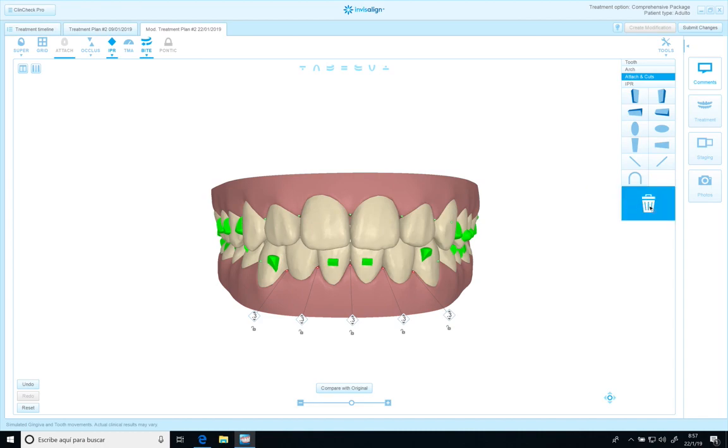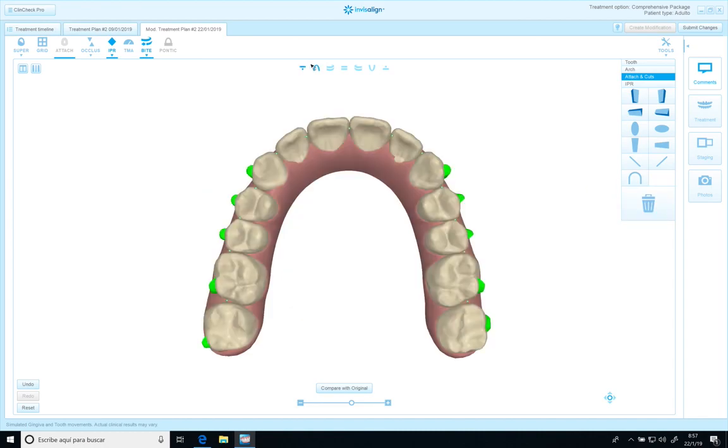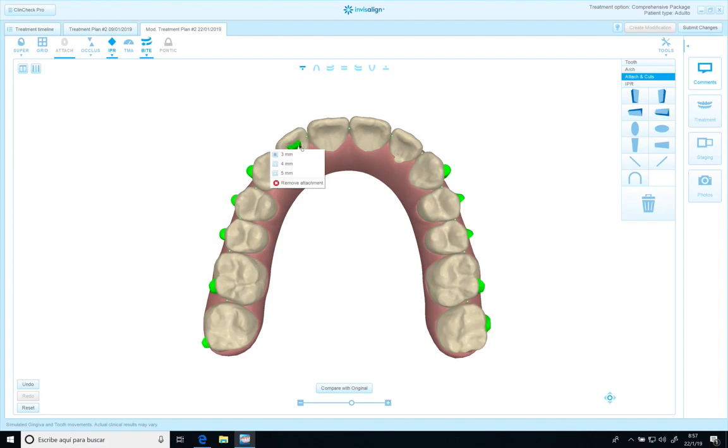Because they are so small, I prefer to put bigger ones in the palatal surface. So I'm going to put this one here. Also, I'm going to change the size to five millimeters, and the same here. I'm going to put it here.